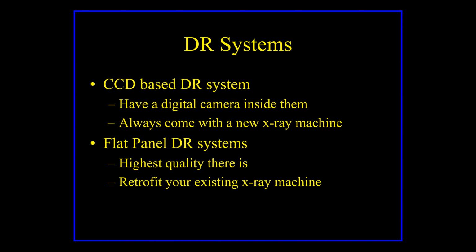Okay, DR systems are much better. Now you have to be real careful when you go out and shop for X-ray tubes and X-ray systems, because there are a lot of unscrupulous vendors that have booths at meetings. I think right now VMX is going on in Orlando, Florida, and coming up in September is WVC out in Las Vegas, and all those big meetings have big exhibit halls, and vendors come in, and their whole goal is to sell you something.